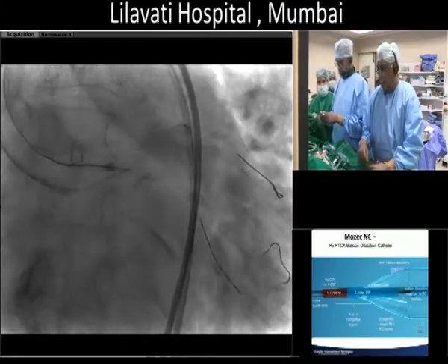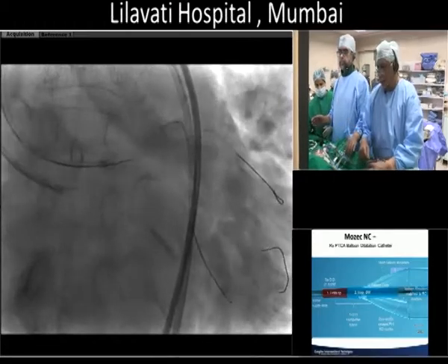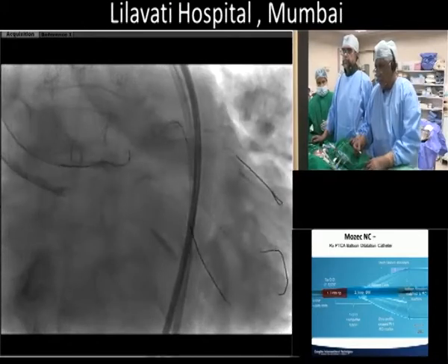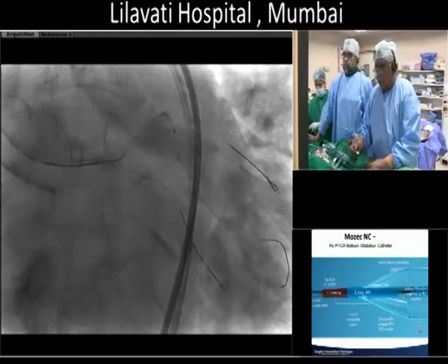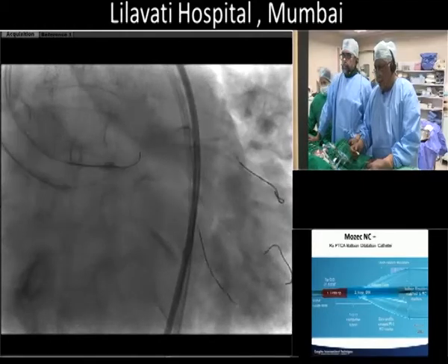You know, this is a steel core wire versus the other one being a nitinol wire. This is a Universal going into the Ramus. I'm trying to. Okay, so you have 4 wires in that one guide. It will be a small test.